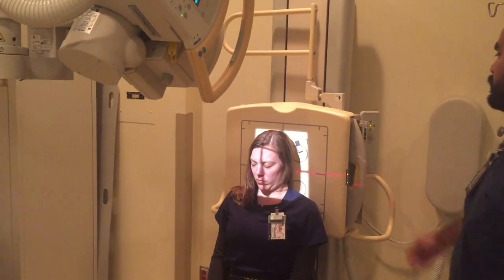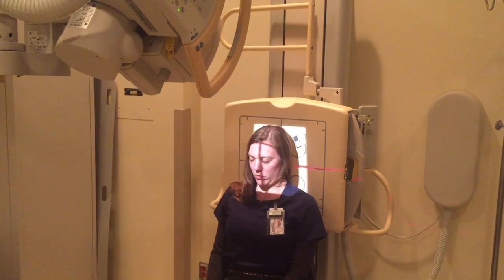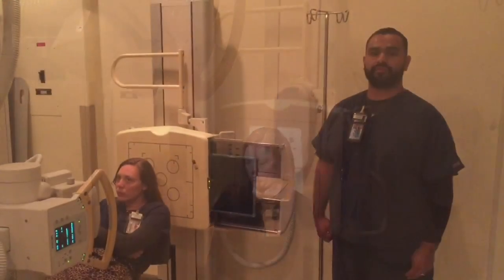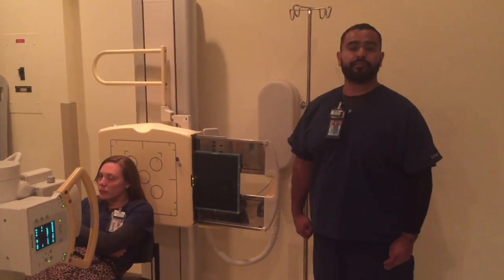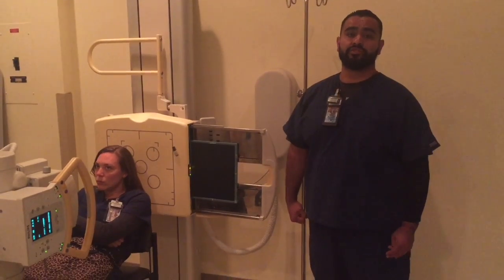So I have my patient positioned. Alrighty, don't breathe. X-ray. Now for my final image, I'll be doing an SMV, which is the Schuller method.